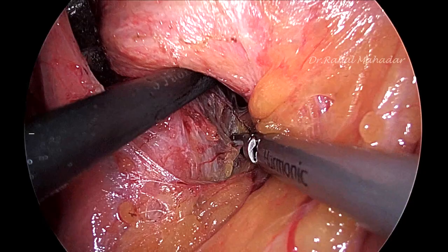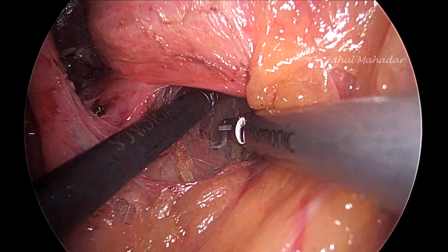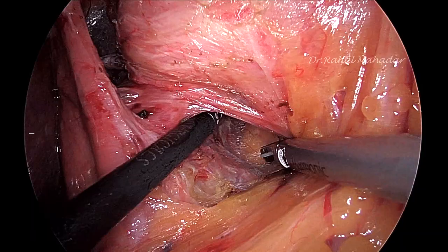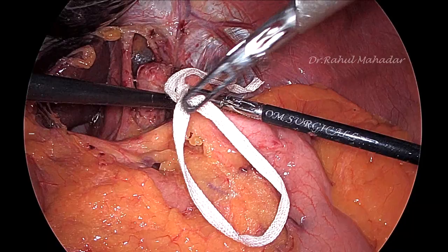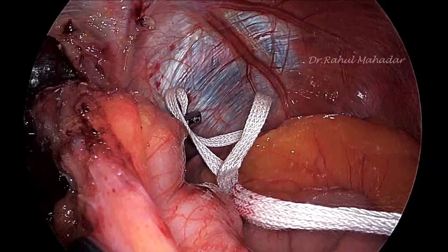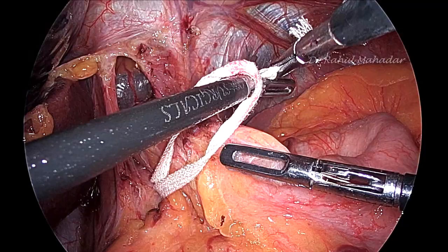Gently you do the dissection with the help of a harmonic scalpel so that you avoid excessive bleeding in this area, because small vessels are there and they need to be cut with the help of a harmonic scalpel. And your posterior vagus is above, you can very well appreciate that. And now you can put umbilical tape around the OG junction so that maneuverability becomes very easy with this traction of the umbilical tape around the OG junction.